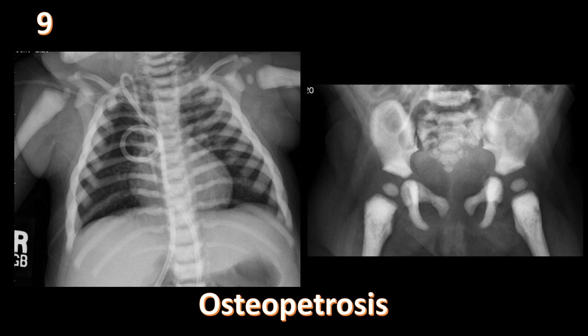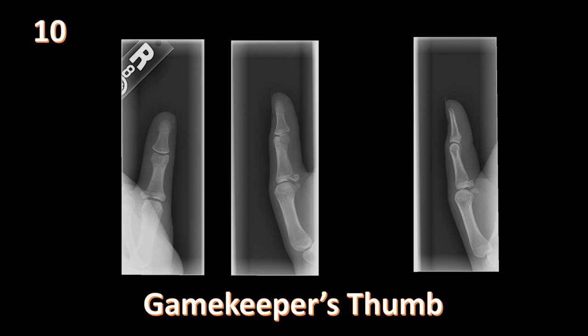Three views of the thumb show an osseous gamekeeper's thumb: there is an avulsion fracture at the base of the proximal phalanx on the ulnar side, representing avulsion of the ulnar collateral ligament. If the radiograph is negative with suspected UCL injury, MRI is performed. On MRI, confirm UCL integrity and check whether the aponeurosis of the adductor pollicis is interposed between the ligament and bone — this is a Stener lesion, which requires surgical intervention. The MRI sign is called the yo-yo on a string.